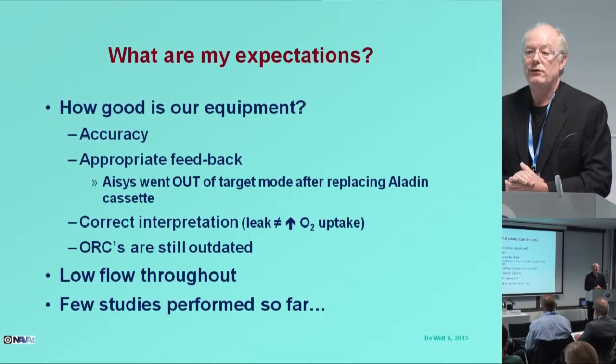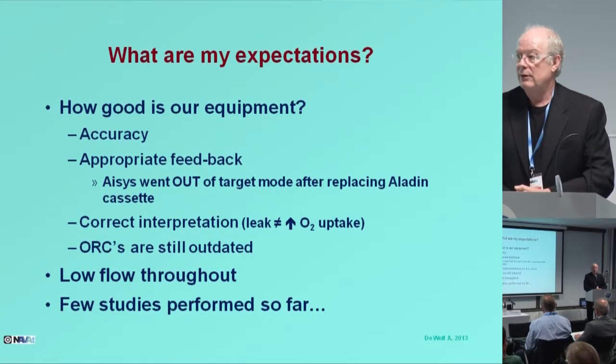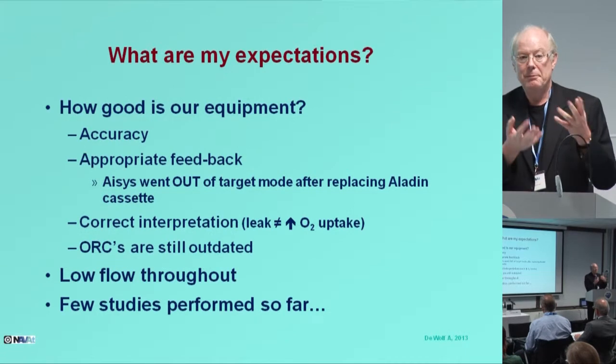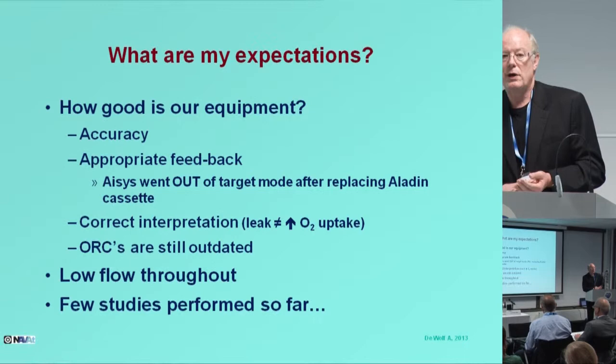And finally, the ORCs, the oxygen ratio controllers, are still not really optimized in conventional mode, and we expect better from our equipment. And I would say that we expect feedback from the measured inspired concentration rather than relying on a kind of arbitrary mechanical system to do that. I want the equipment to use low flow throughout, but there are very few studies that have really looked at the true performance of these pieces of new equipment.